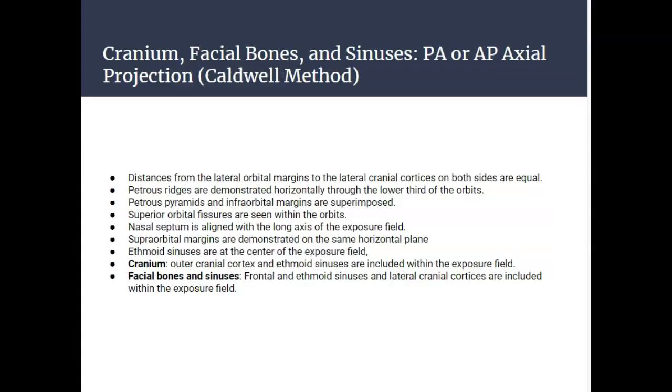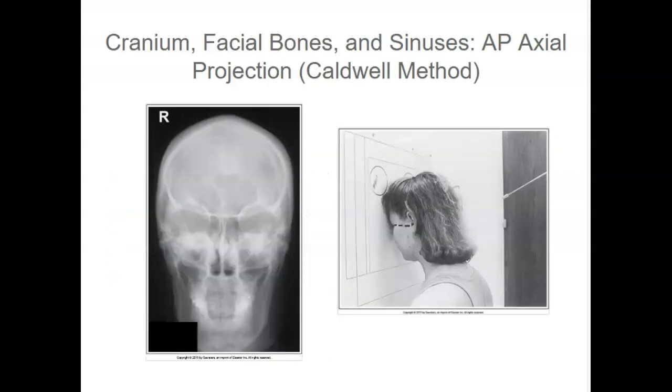I have included the image analysis guidelines for you to review. And here is an example of an adequately positioned AP axial projection, even though the live person they're demonstrating on is in a PA projection. The image demonstrated here is an AP axial.